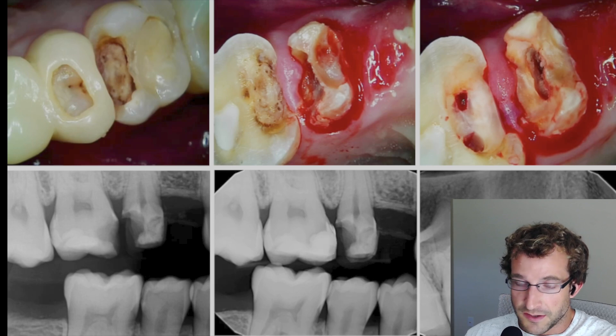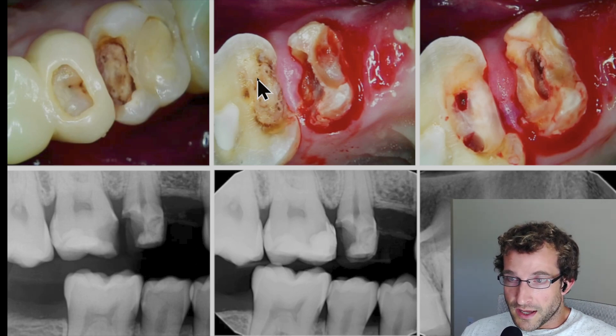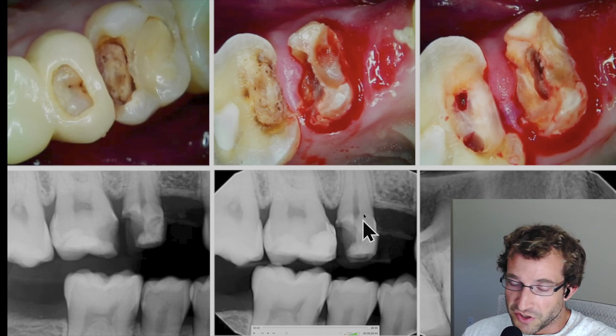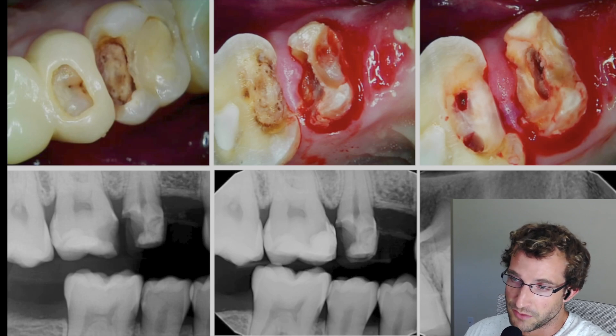Unfortunately the patient did not book the appointment until the 1-6 fell out and the tooth developed irreversible pulpitis. So we ended up making a plan to do 1-6 endo, 1-5 endo, and then buildups and preps to deliver a cantilever bridge which we made in-house.